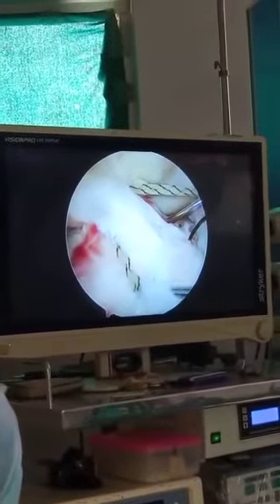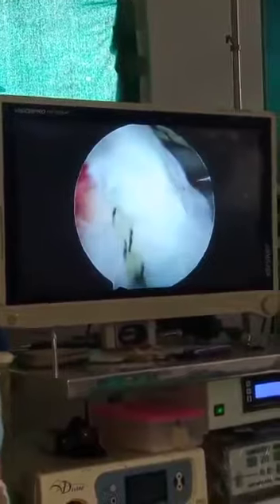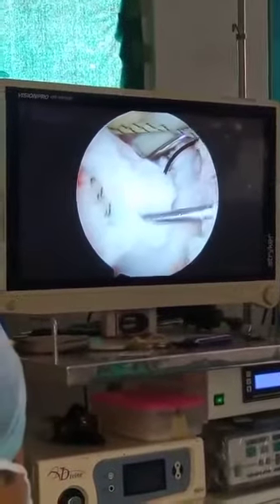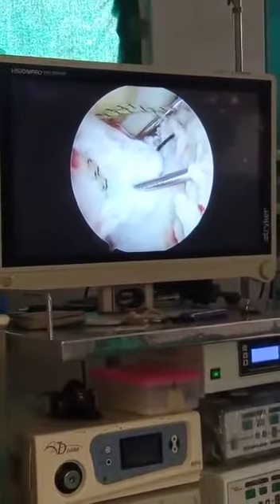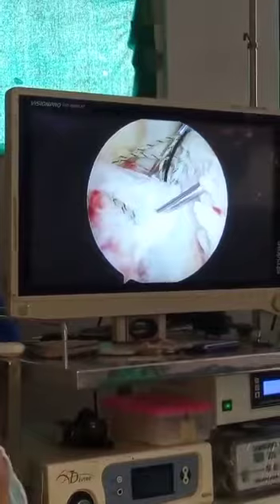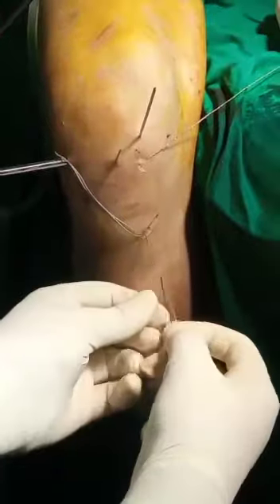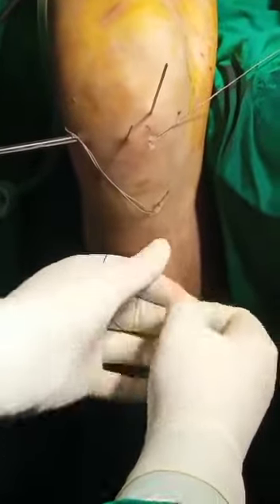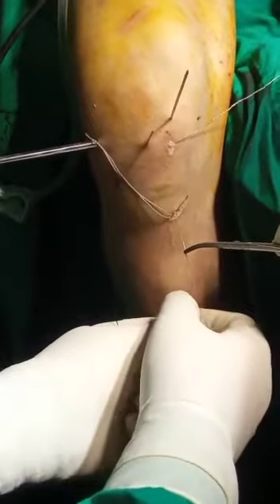Using the suture viper, the thread from the lateral tunnel is passed intersubstance. For the anterior fixation, this black thread is now routed out. One thread is for the anterior and another will be made for the medial. Then we will tie it and concentric reduction will be achieved.